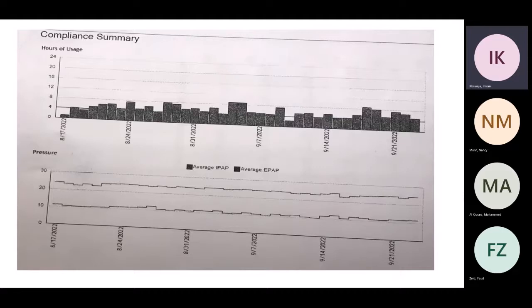And if you see here, the IPAP is hovering around 23, 24, never above something like 25, and never above that. Just keep that in mind. For me, when I saw this, it's like, well, the pressure support is dialed maximum at 14. So that means the patient was reaching the pressure support every time. You see what I'm saying? Yeah. Because it could have gone more than this, but you're reaching the maximum.